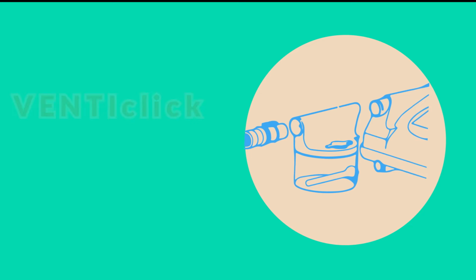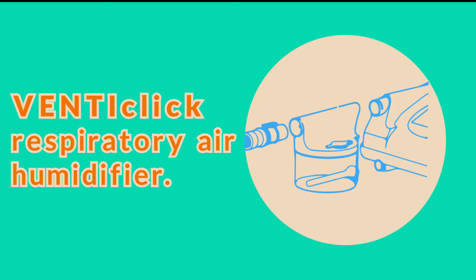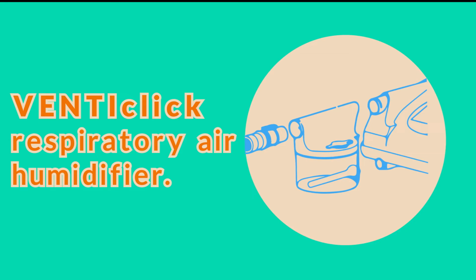Another accessory is the VentiClick respiratory air humidifier. The VentiClick respiratory air humidifier is plugged between the device and the tube system. The input connector stub and the electric connection for the heating rod must be pointing towards the device.